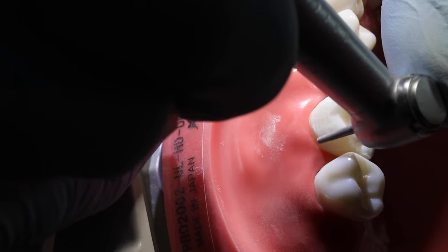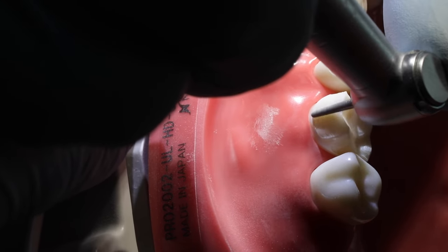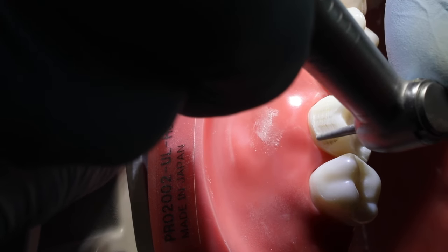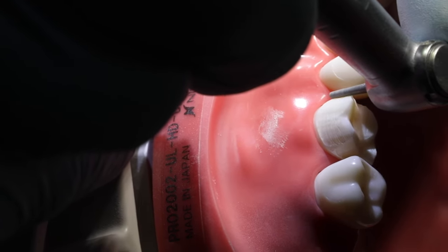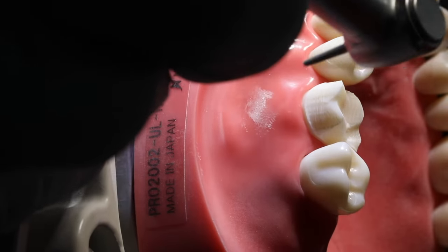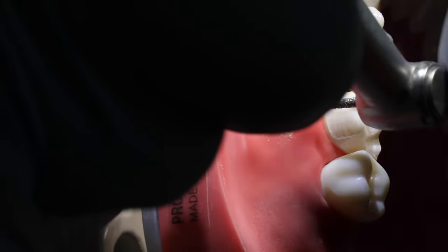With this diamond, it's very easy to get a J-lip, to get a little ski jump at the margin, and those are an absolute no-no. The scanners don't know what to do with them. You almost invariably will end up with an open margin there. It'll either break or it won't scan properly. And we'll check ourselves on axis. It looks good from this angle.